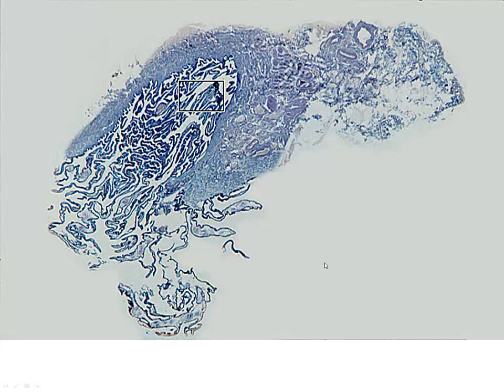Here we have a section through the infundibulum, or the end of our oviduct, and we can also see these sections of these finger-like processes called the fimbria extending away from the infundibulum. Here we have the opening, or section through the opening, and all of these curled ribbon-like structures that we see. These are the fimbria portion of the infundibulum of the oviduct.